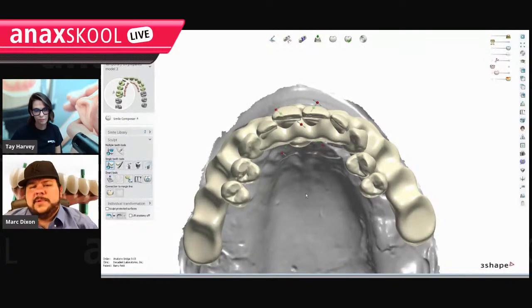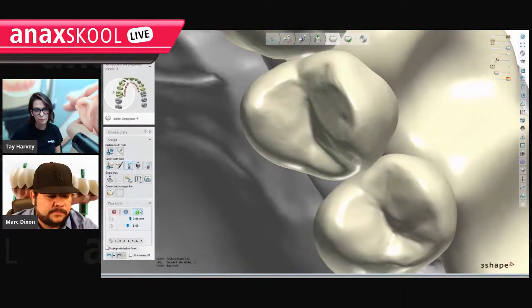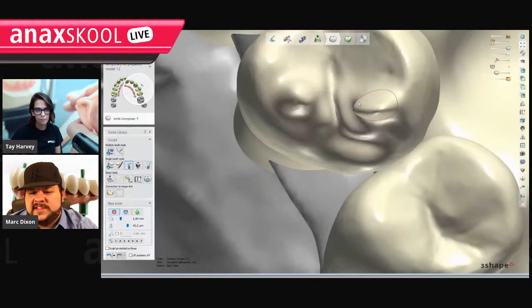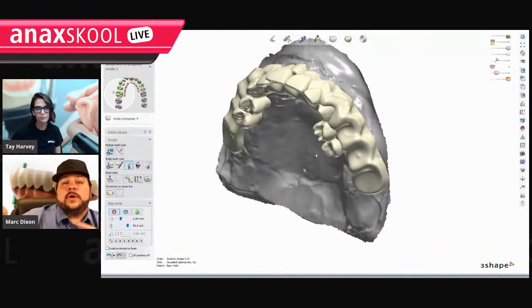Tissue takes a long time. It takes a long time to sculpt because this is a little tiny tooth. And when I grab these tools for sculpting and I go to, let's say, add a little something here, it's crazy. It's powerful, right? It's too much. But on this, it's so big, you just sit here all day. So it's not fun. So that's one way to do it.